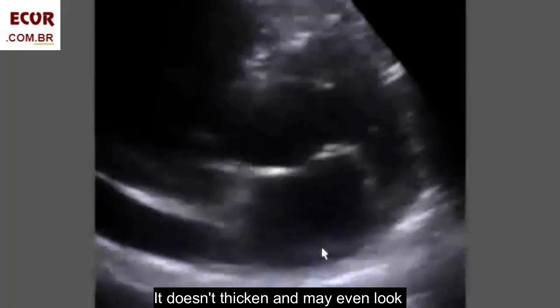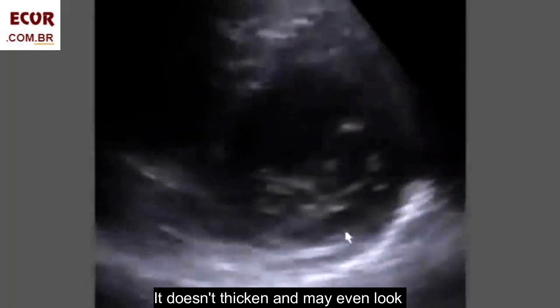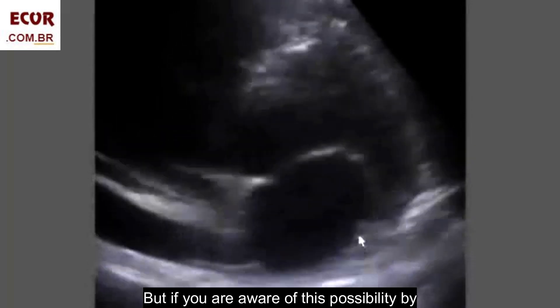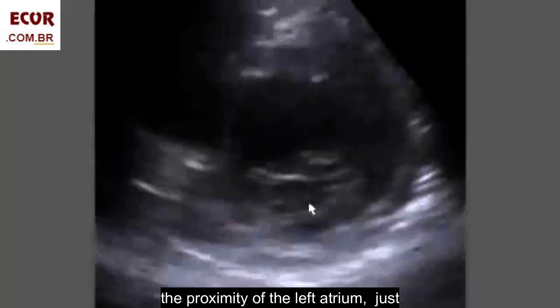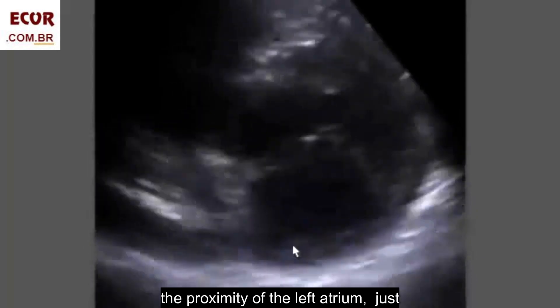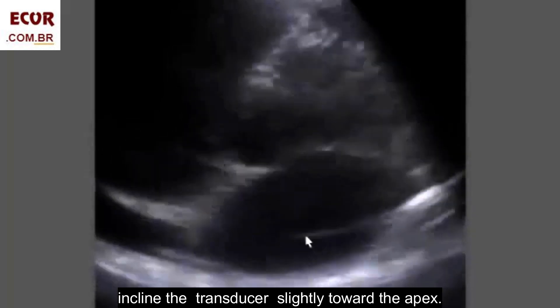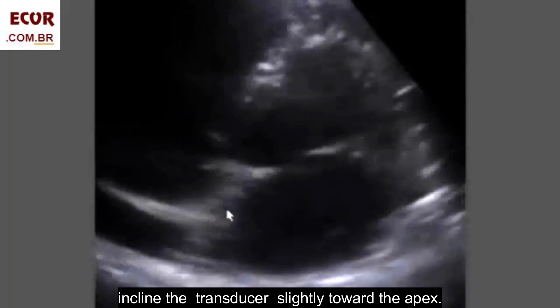In this case, it doesn't thicken and may even look akinetic. But if you are aware of this possibility by the proximity of the left atrium, just incline the transducer slightly toward the apex.